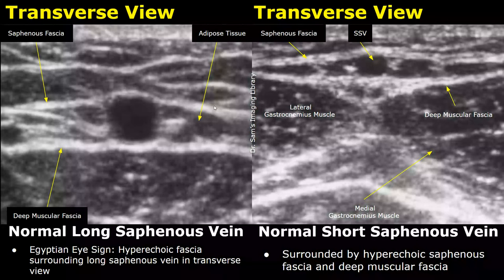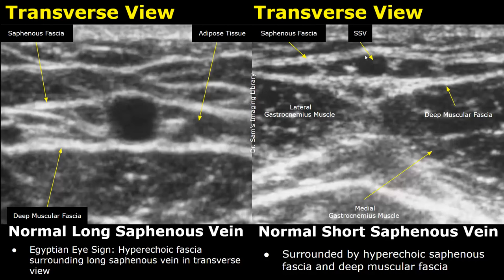These are transverse views showing the long saphenous vein, or the great saphenous vein, and the short saphenous vein, which is also called the small saphenous vein. The long saphenous vein can be seen between the hyperechoic saphenous fascia and another hyperechoic deep muscular fascia, and this hyperechoic area is the adipose tissue.